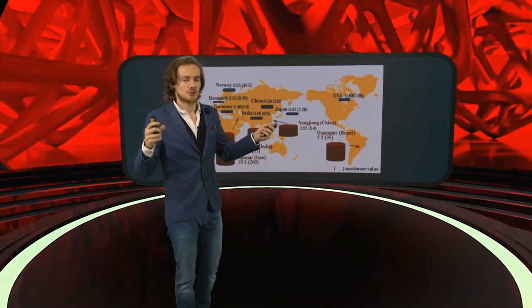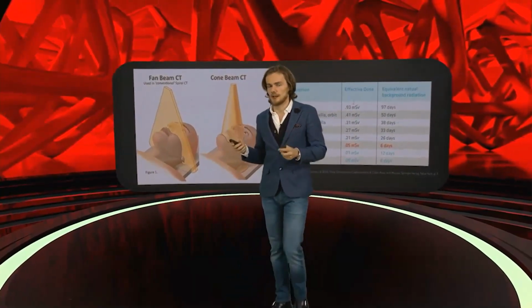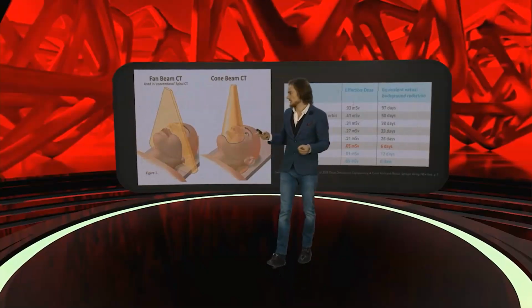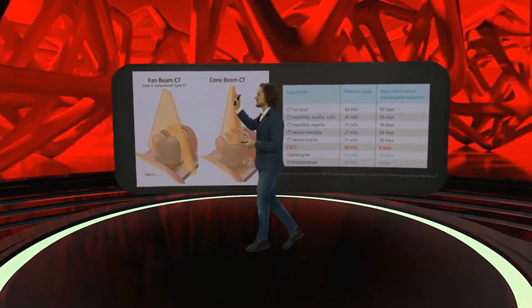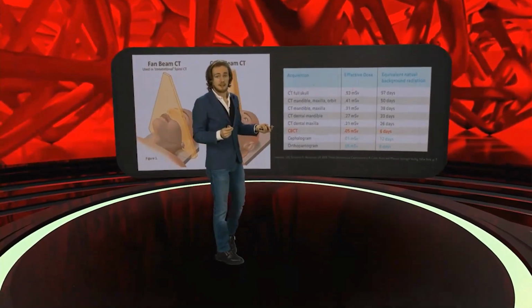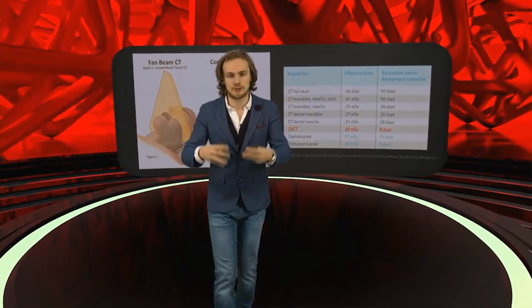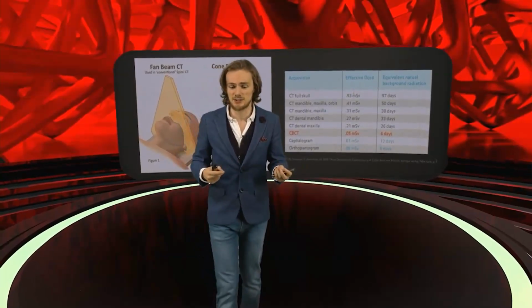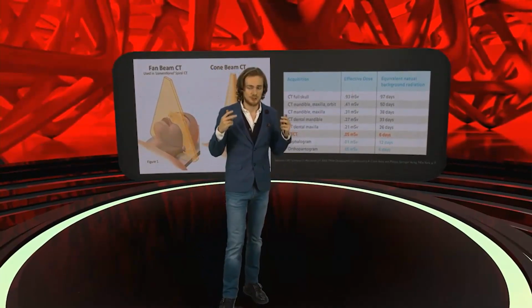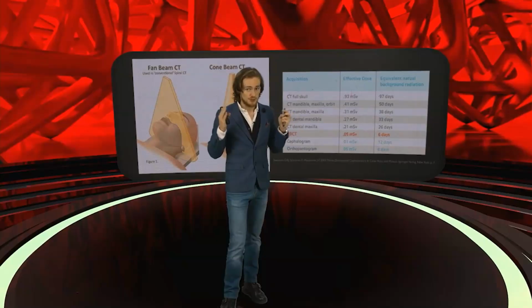So do we really have to be so worried about radiation in dentistry? If we speak about digital radiology, it is not that big a deal as it was in the past. If we speak about CBCT, it's not that big a deal as it was with typical tomography. We are going further and further with radiology, so we are reducing the dose. So I do not think it is necessary to be so afraid of taking pictures, but let's be reasonable.